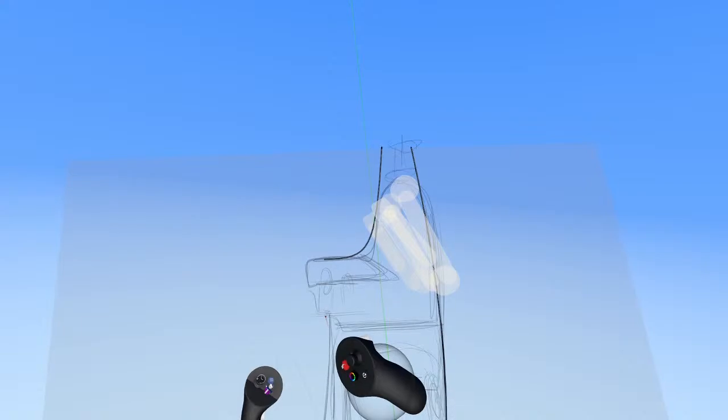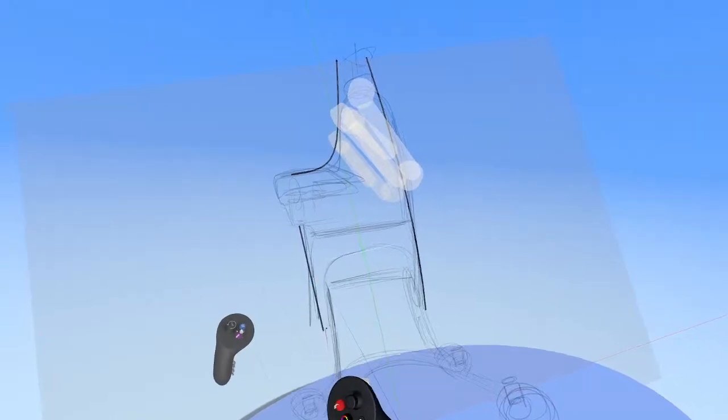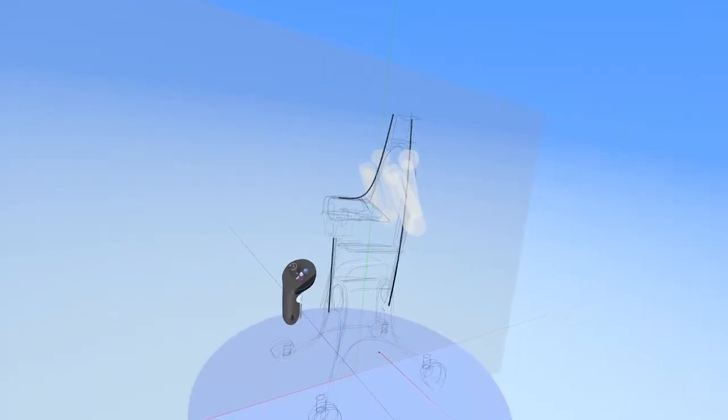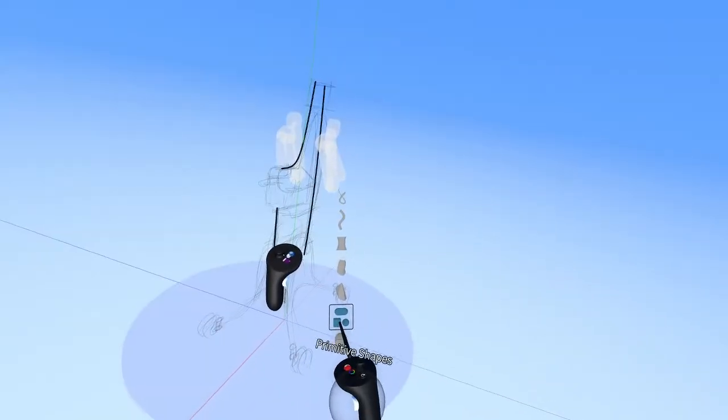Like this. And like that. And by the way, I just figured out one other thing that I'd like for this robot to have, and that is a small screen on it so that you can see what it's seeing. Or a touch screen that you can interface with it. So before we go any further, I just want to drop that in.